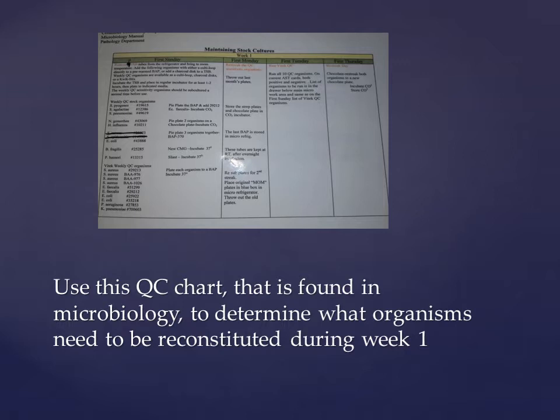Every 4 weeks, new bacterial organisms need to be grown from a pure source to prevent bacterial mutations. Bacterial mutations could alter expected QC results. We use 3 different types of stock organisms: culture loop, charcoal discs, and a quick stick.